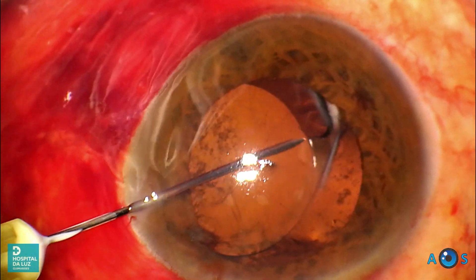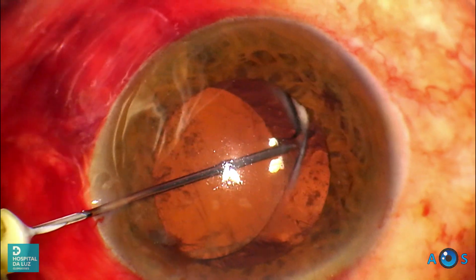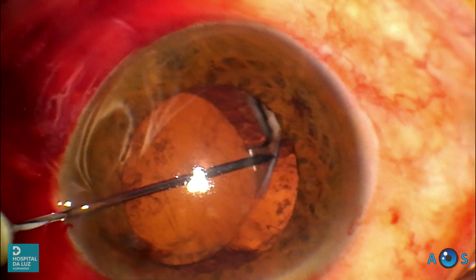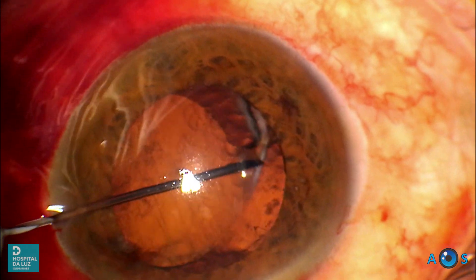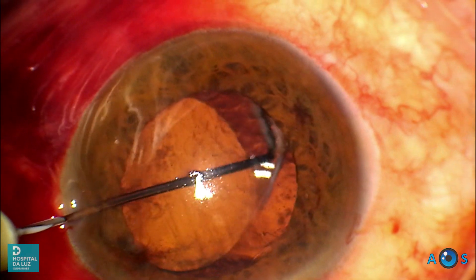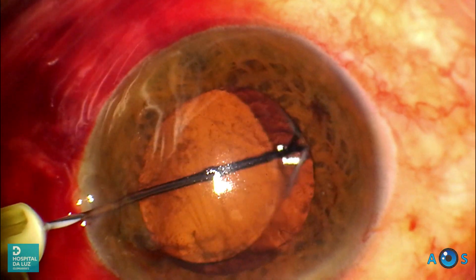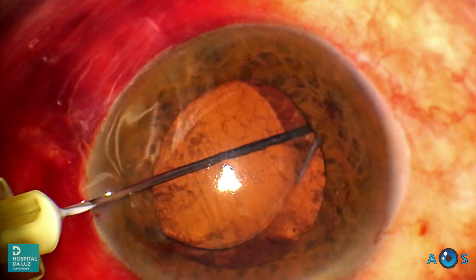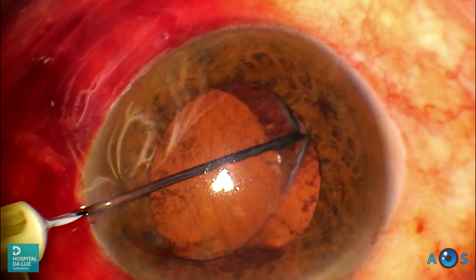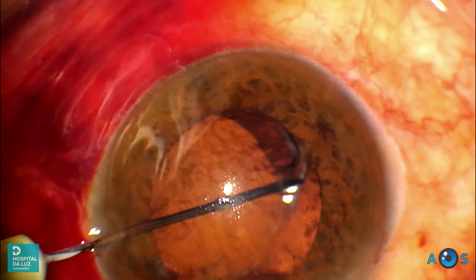Now we will use a 27-gauge needle attached to the OVD syringe to further dissect the capsular sheath from the IOL. This is a delicate maneuver — the goal is to lift the fibrosed anterior capsule with the needle and simultaneously inject OVD underneath it, to progressively release the intraocular lens.